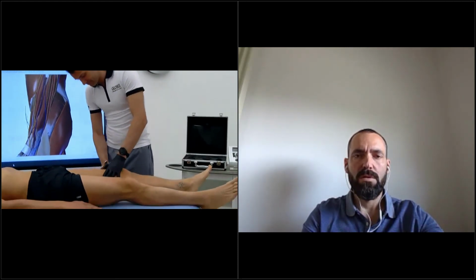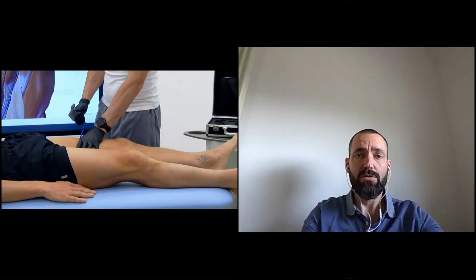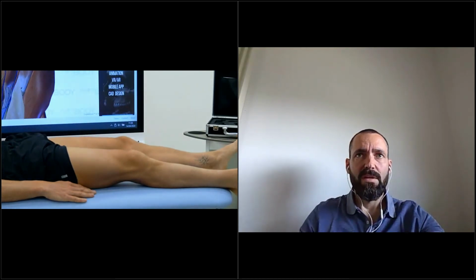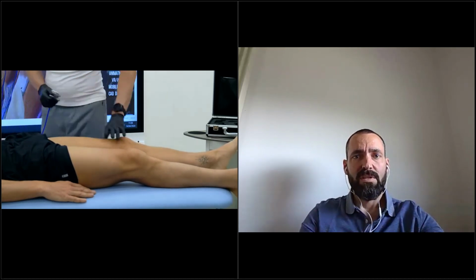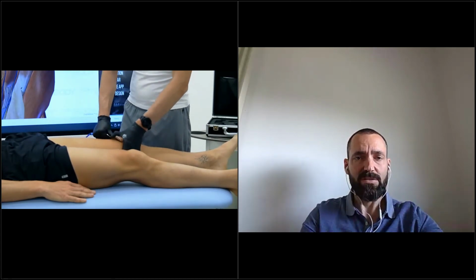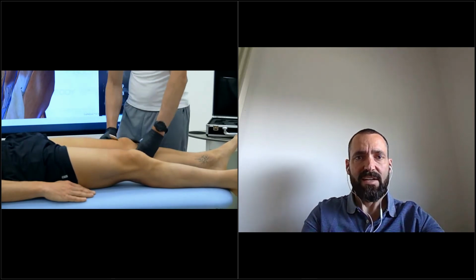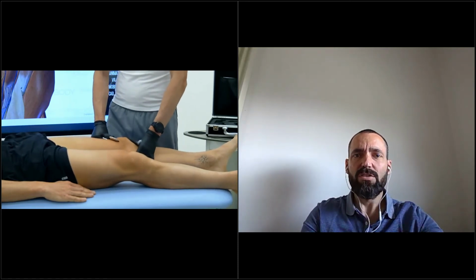My last case was a guy who had a lot of pain in the low part of the belly. There was big stiffness in the iliopsoas, and absolutely no pain in the adductor. We did a few treatments: rectus abdominis, iliopsoas, manual treatment, decreasing tension of all the hip muscles, gluteus, TECAR on the pubic symphysis, manual treatment everywhere, and no good results.